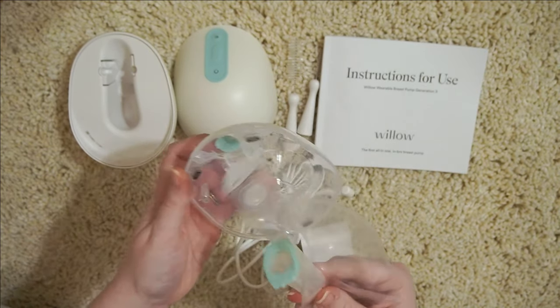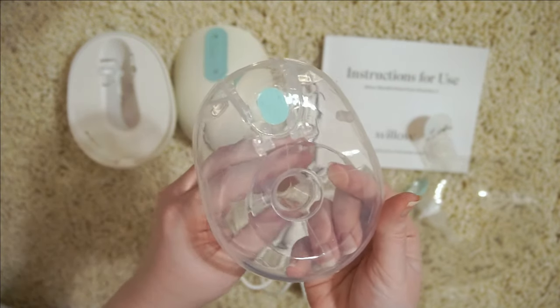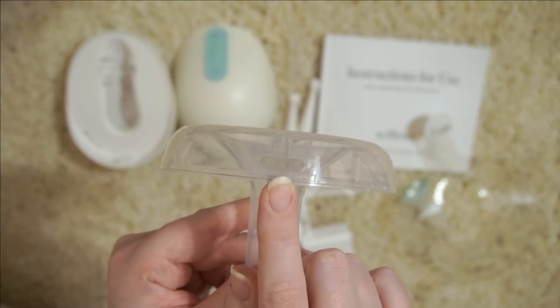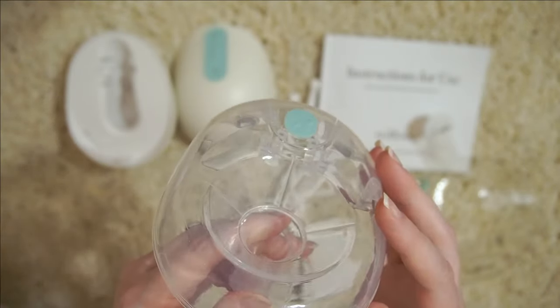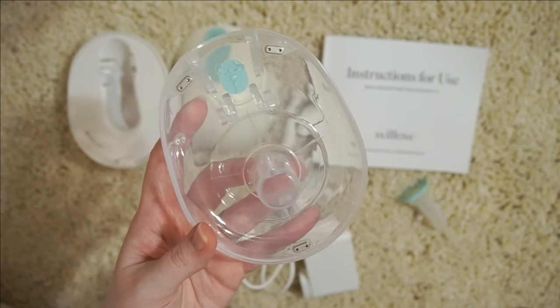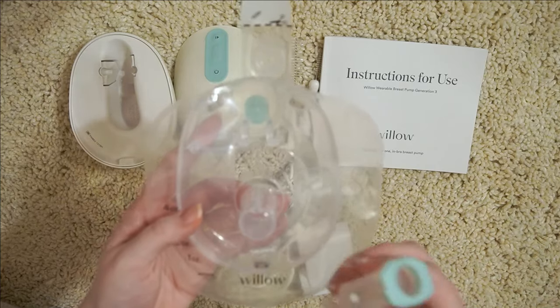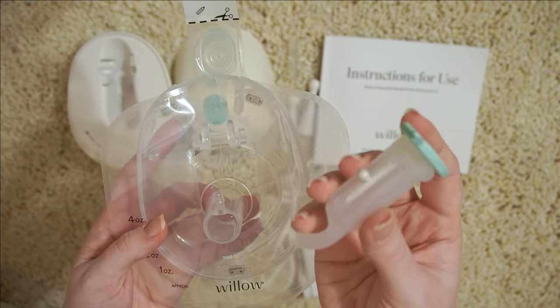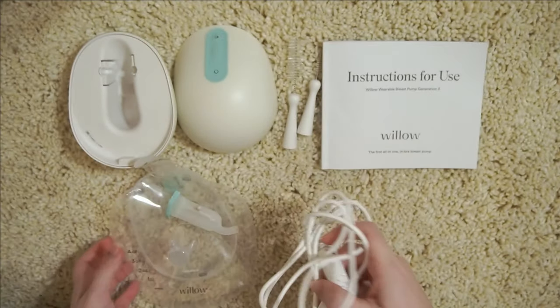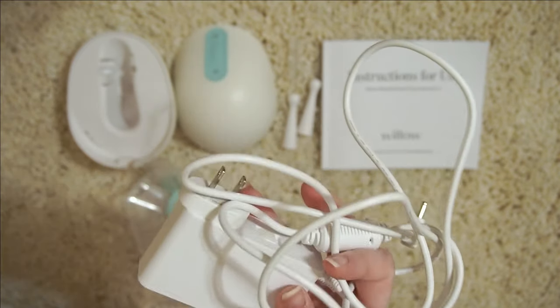Over here, this is the flange. Depending on whatever size you may get depends on what will be in your box. I am a 21 millimeter flange and you can see right down here, that's where it's labeled. With the flange, you use the bags — so you will also get some bags with this as well. And with either of the flanges, you will get a flex tube. This is what it looks like — that's the part that attaches to your flange. Of course you also have a charger, but there's only one of these, so you will have to charge them one at a time.